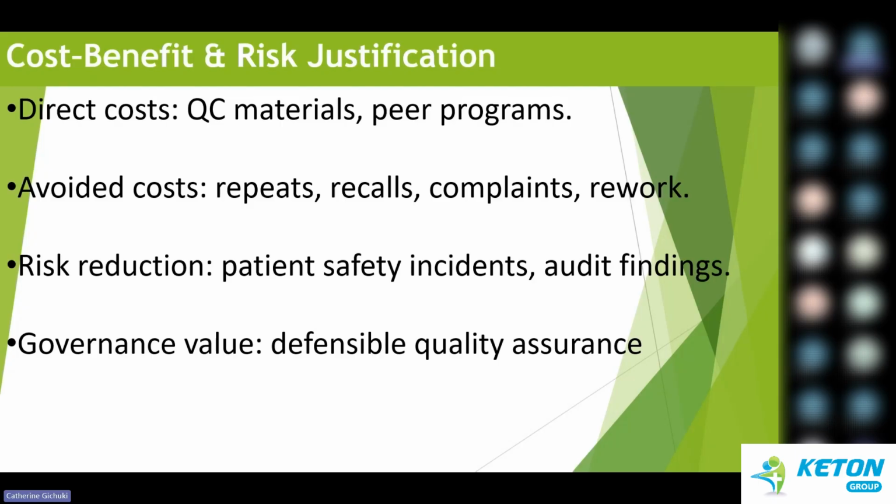Then you're reducing the risks, and the chances of patient safety incidents usually go down, and you find very little negative audit feedback. Then governance value, defensible quality assurance, where you're providing strong and defensible evidence that the lab has a robust way of assuring quality in its system.